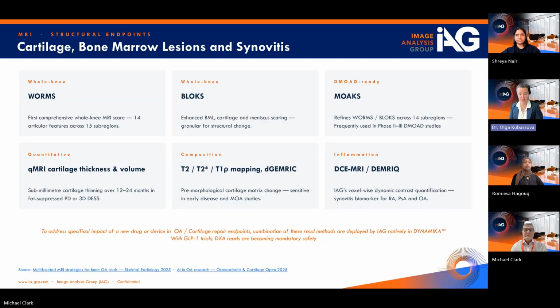To conduct that measure, a reader needs to place 2 lines around the knee joint and then measure space. So of course, AI would do a much better job, especially given that X-ray of the knee is so well studied. However, you can't just purely submit the AI-generated measures as part of your phase 2 or phase 3 submission.